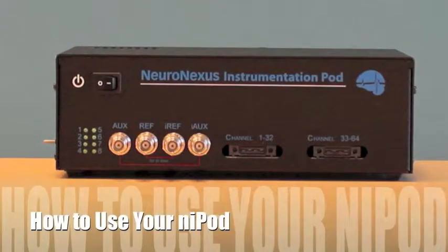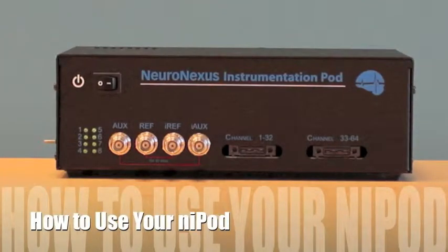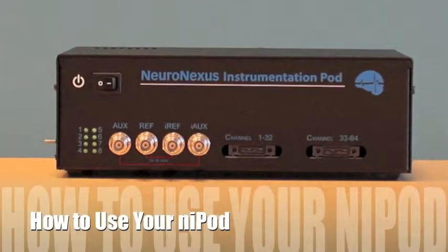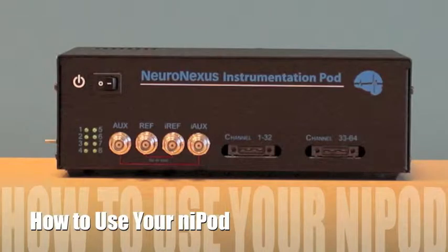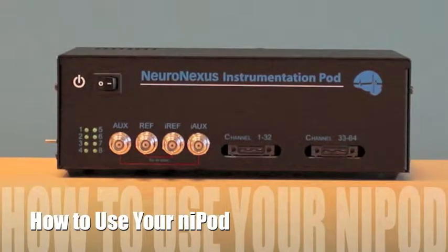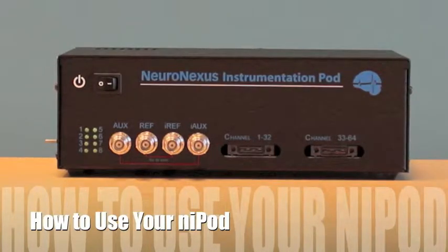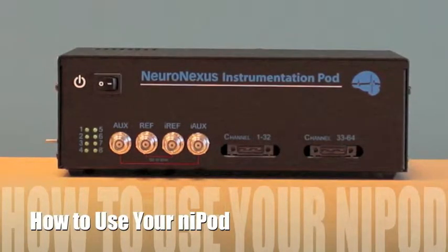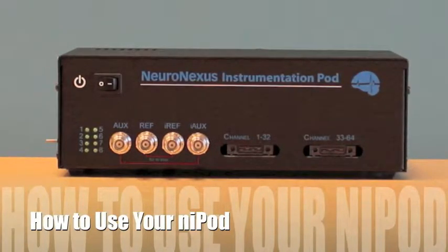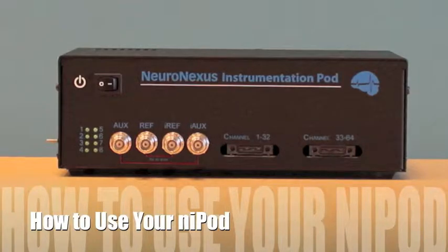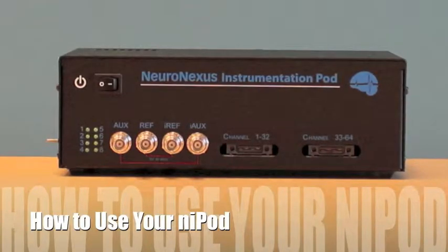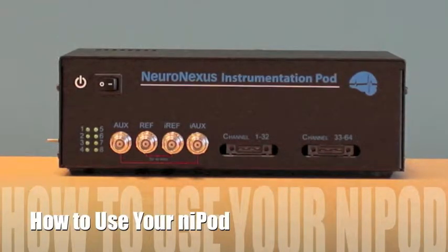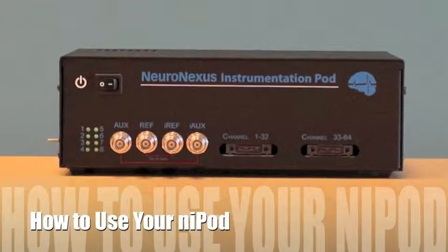In this video we will show you how to set up and use your Nipod. We will begin by showing you using the calibration dummy setup. Then we will show you how the in vitro setup works with a real probe. This video will focus on impedance measurement, so check other videos for other features.